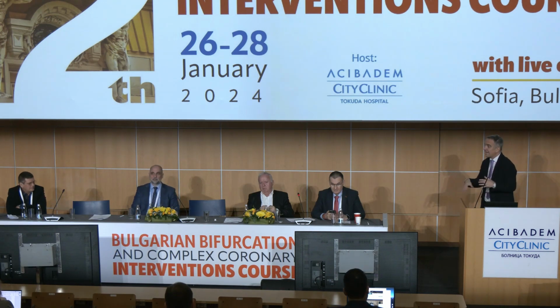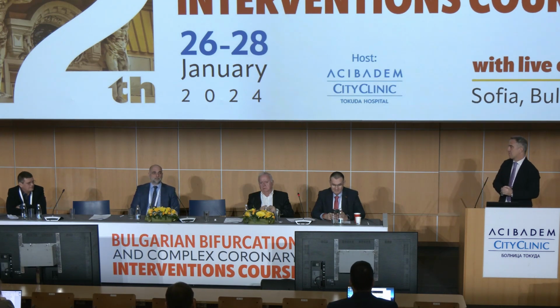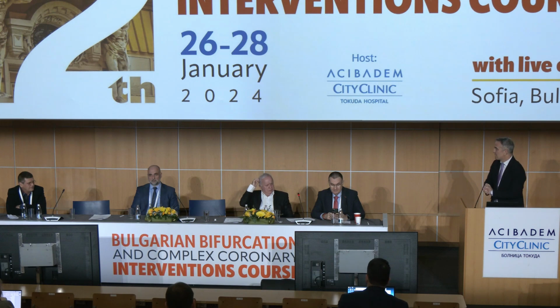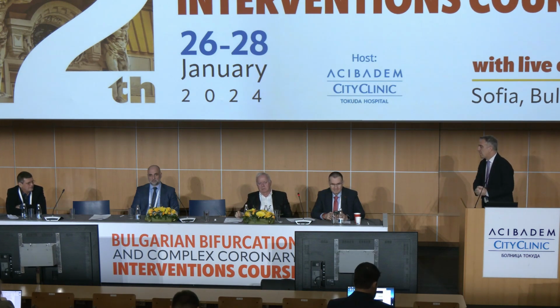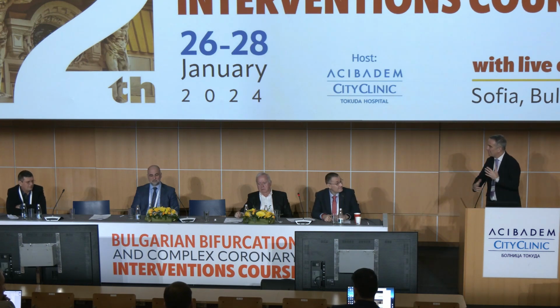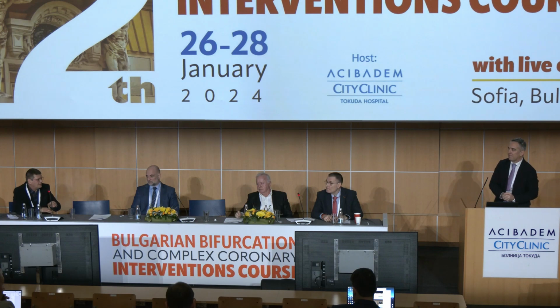Also the staff in the cath lab, how to reduce radiation. Not to film, for example, when a nurse gives some drugs into the blood. Some people just film, and she comes there, and we need to take care of everyone, for everybody.